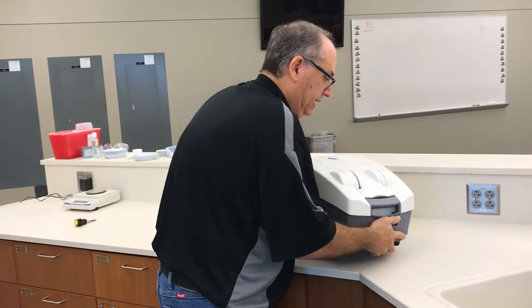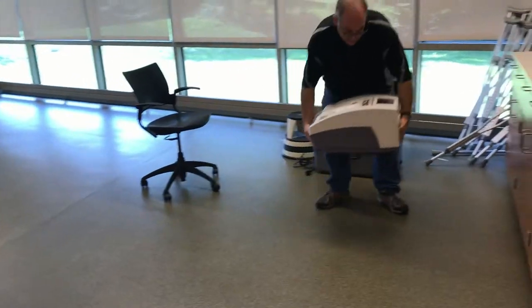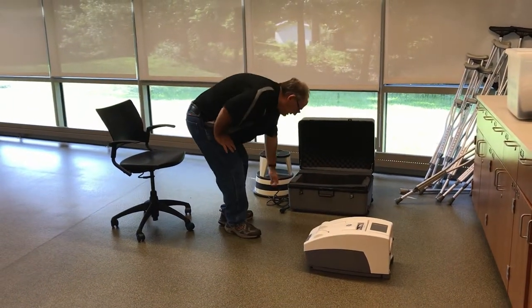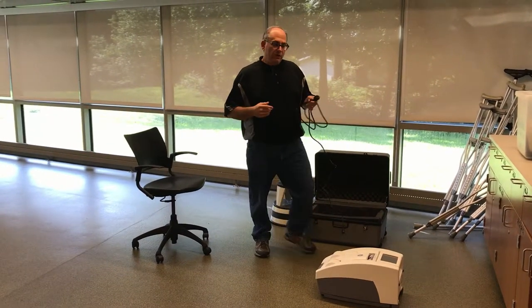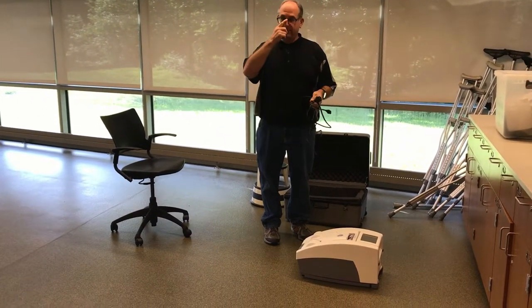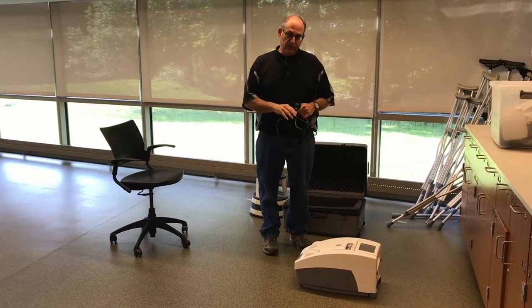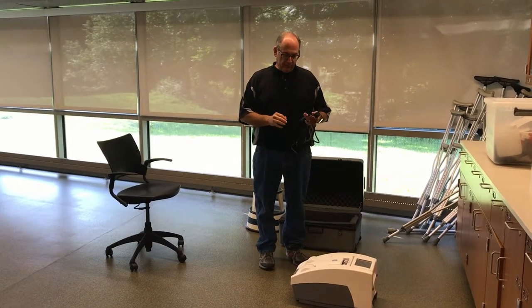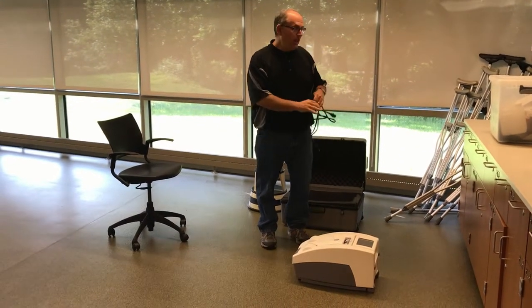The next step is to take the device to where you're going to run the test. Attach the power cord and turn the machine on. The machine has to warm the water, so you can't run the QA or do your test for about 10 to 15 minutes after turning it on. You want to get the membranes on, everything in the machine ready to go, and get it plugged in well before testing.